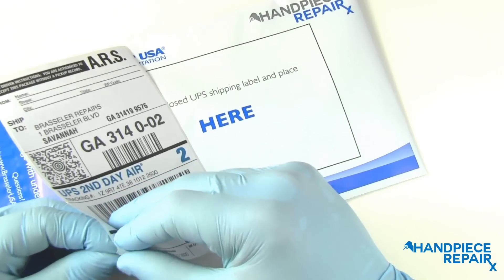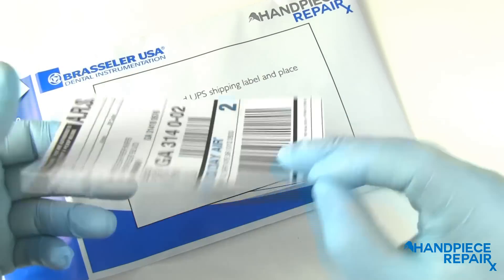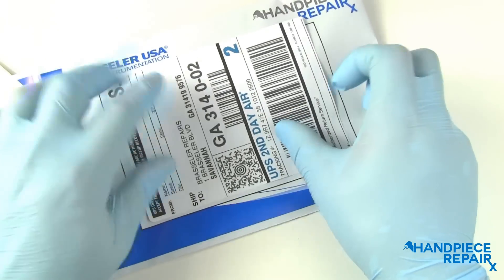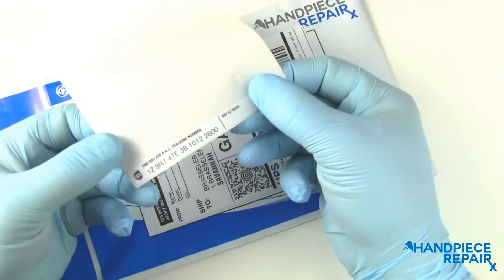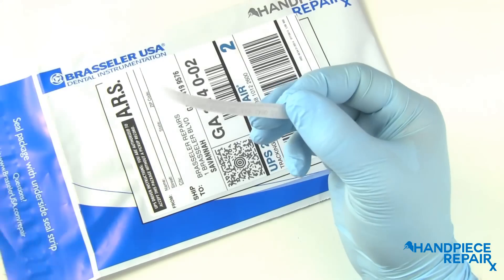The next step is to place the UPS shipping label on the cover of the repair bag. You are able to peel off the bottom section of the label and keep it for your records.